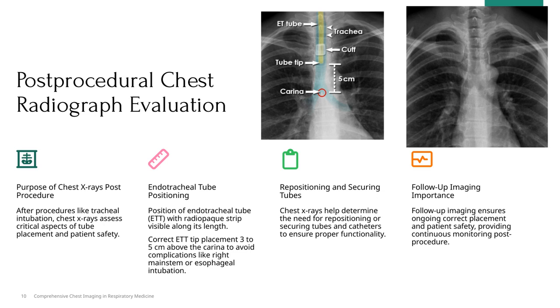Finally, follow-up imaging is equally important. It allows us to continuously monitor the tube's position over time, especially after initial placement, to ensure ongoing safety and proper function throughout the patient's recovery. This ongoing vigilance is a key part of comprehensive respiratory care.